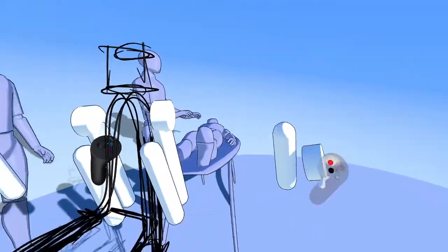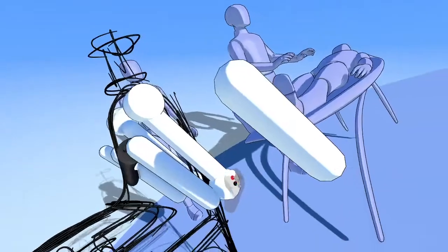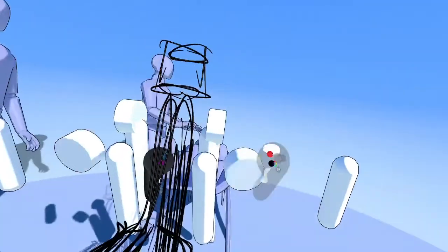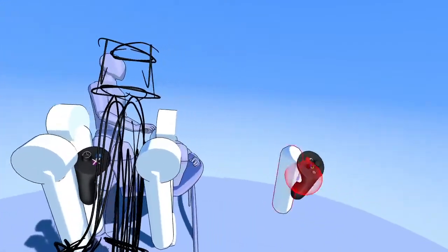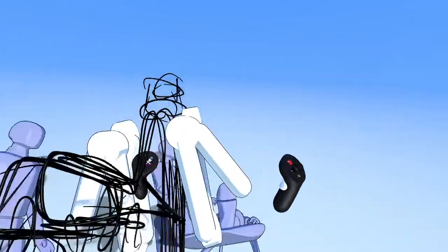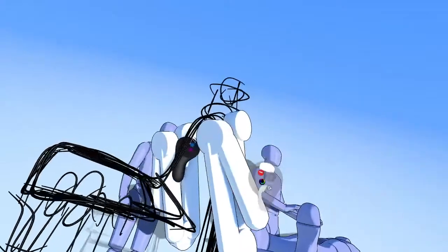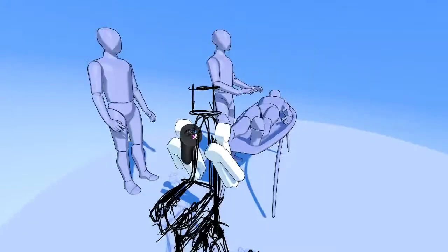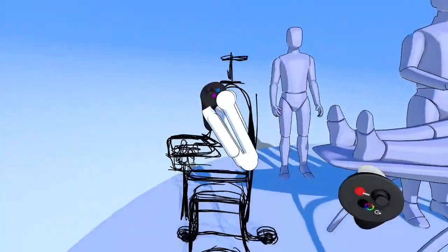And let's move this out right now. And one here for the elbow, so something like that. And then we can have this one turned sideways like this for the last bit of the arm and where the drill bits will be connected. All right, so that looks pretty decent. I think we have that figured out.